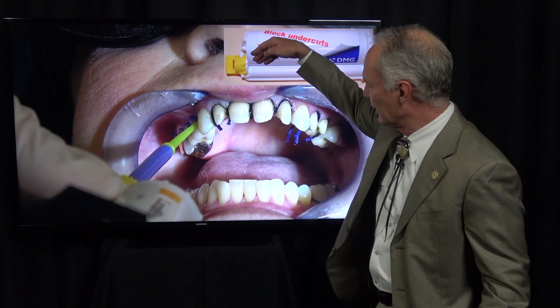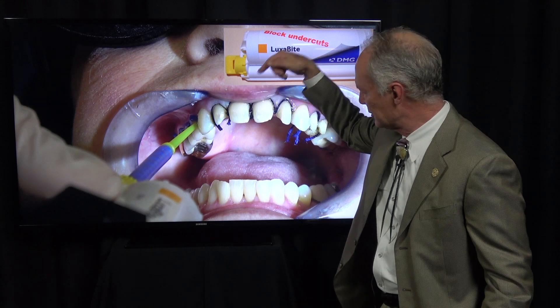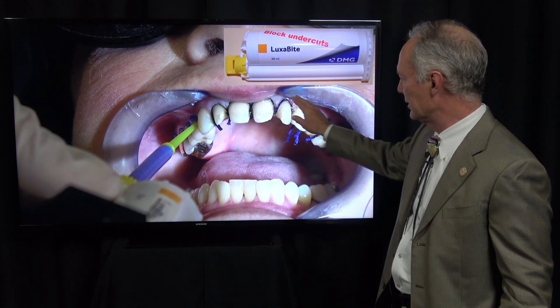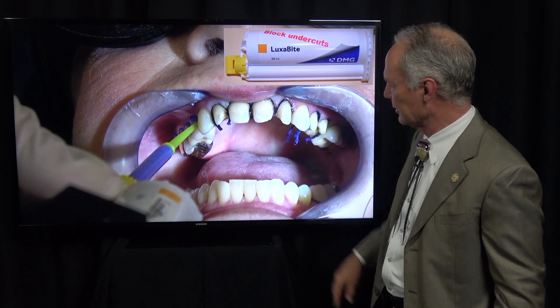When placing the cord, push it into the tooth so it slides down the tooth into the sulcus. But you can still see the cord — it's not buried. You just want to open the sulcus.